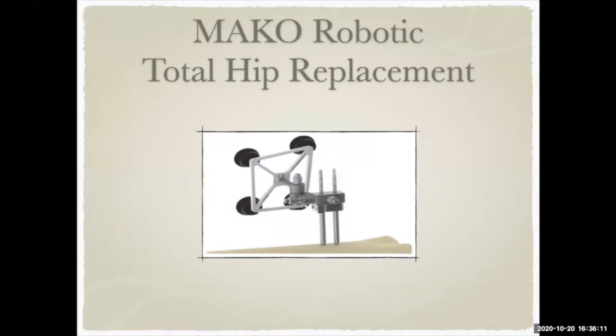So any changes, any minute movement changes that happen to the patient during the surgery, the robot knows that, hey, this patient's changed in position where I think I'm going to have an action. That person is no longer there for me to have that action. And therefore the robot needs to make adjustments in its position and angle and so on and so on.